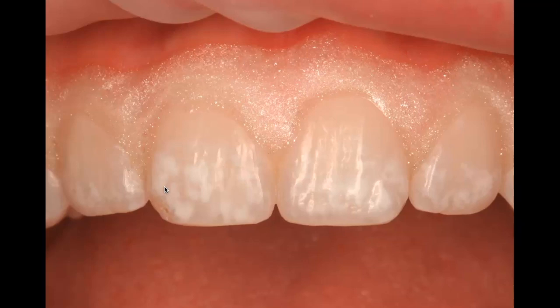So what you do is you isolate. This is a gel barrier here. This is just drying off the teeth. So you can see, as most of these developmental white spots go, the more desiccated they are, the more that you see them. Which tells you what? What does that tell you, the fact that it changes color? Yeah, and why do you say that?